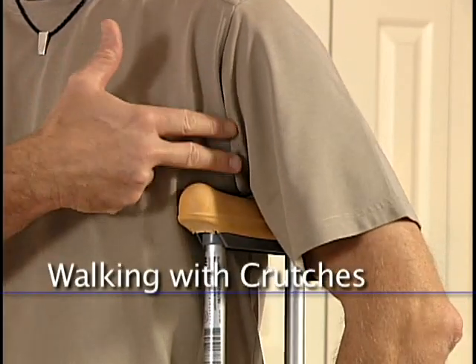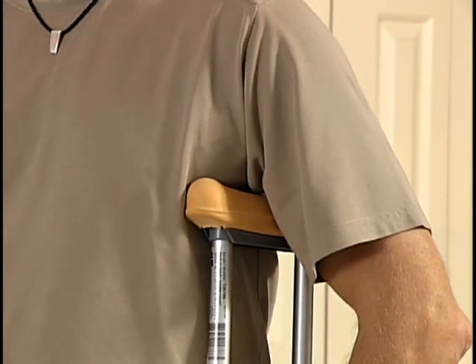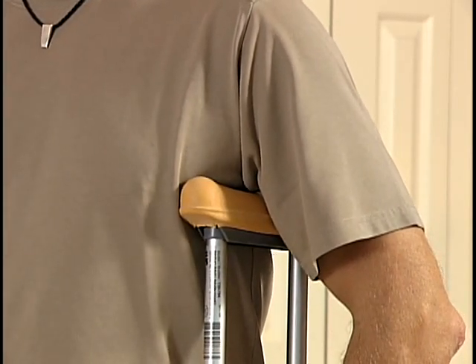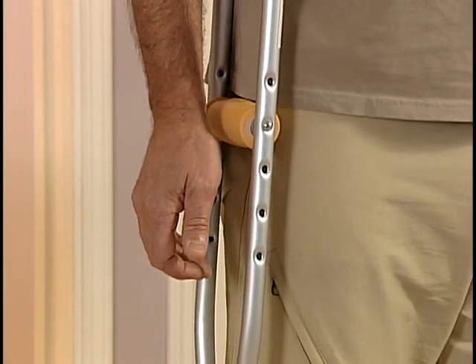Before using crutches, adjust them to fit you. Crutch height should be 2 inches below the armpit, so that there's no pressure on the armpit. Standing straight with arms at your side, the handle should be at the wrist crease.